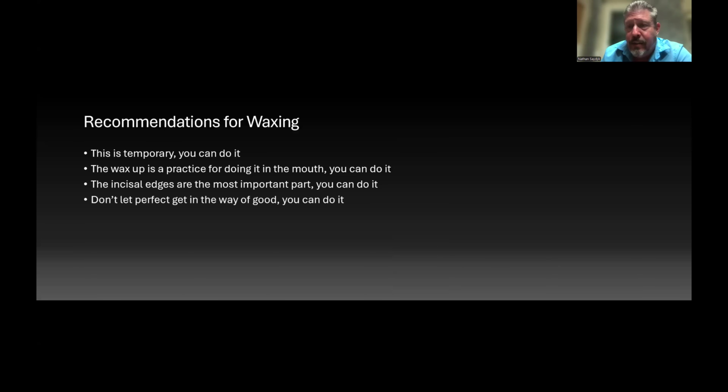Don't let perfect get in the way of good. Just get it done, get the basic shape right, and get it done in the mouth. When you do these cases and you're doing bonding in an entire mouth, it's a decent amount of money for this patient, right? But it's not crown and bridge money.